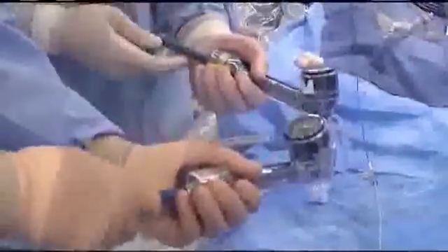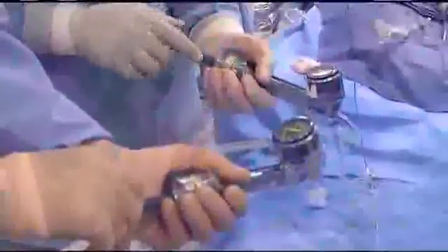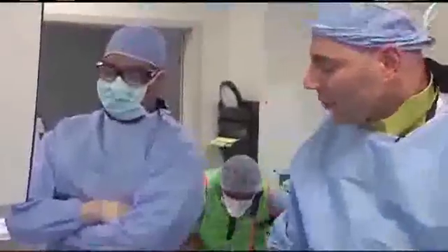Okay, so what we're going to do right now is simultaneous kissing, and we're going up simultaneously as we visualize the vessel to make sure there's no pinching off. Okay, let's take out this balloon once it's deflated.